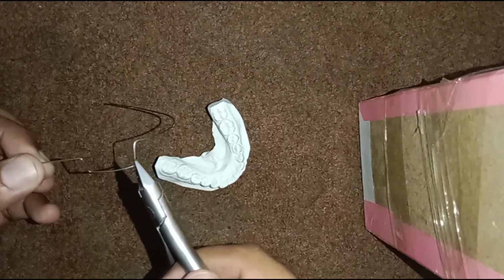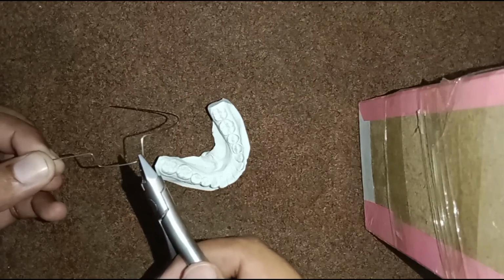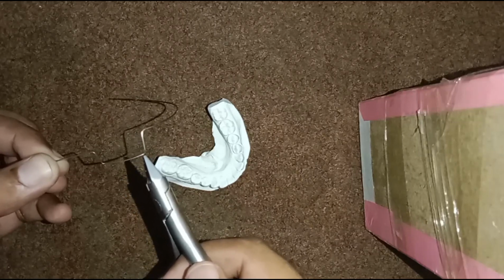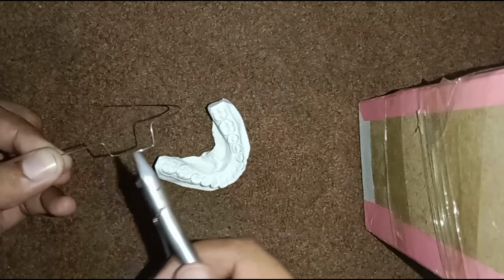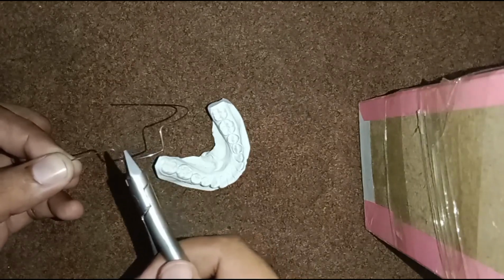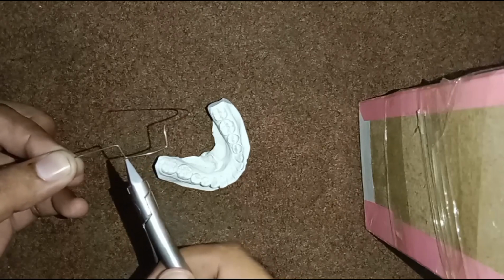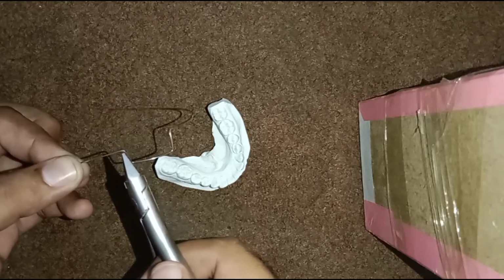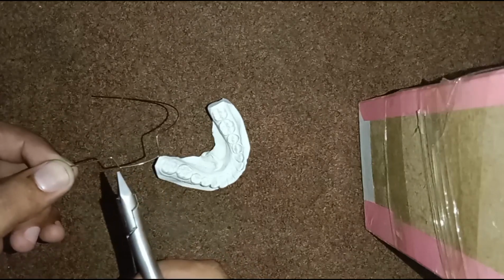Then at 6 mm, or 6, 7, 8 mm depending upon the depth of the vestibule of the patient, we will give it a 90-degree bend to bypass the 3, 4 and 5. Then mesial to the molar, we will again bring the wire upward and bend the wire again at 90 degrees, 3 or 4 mm.